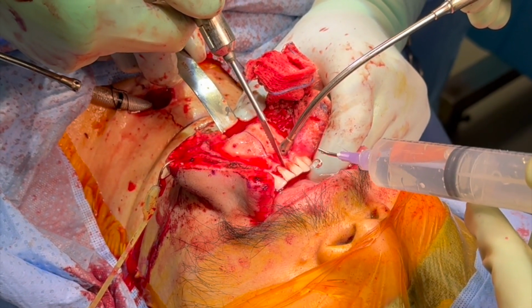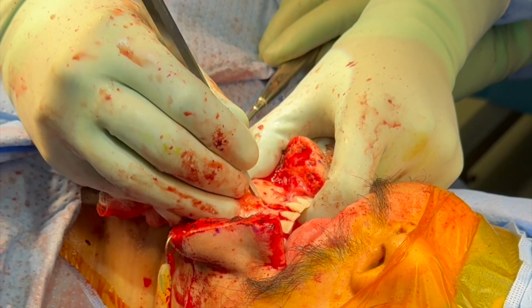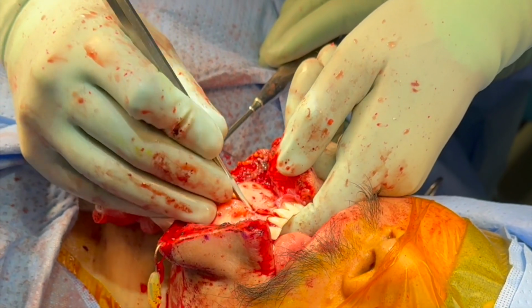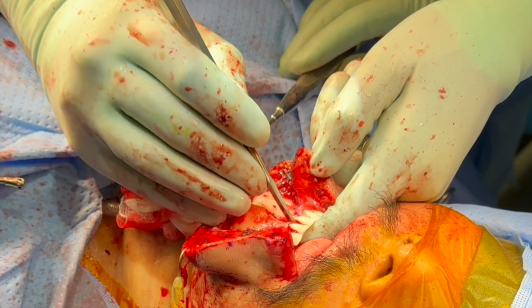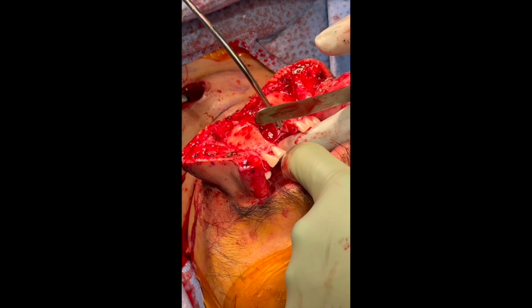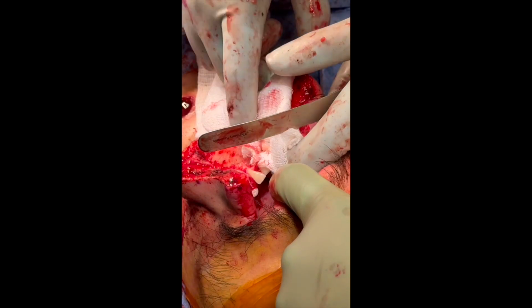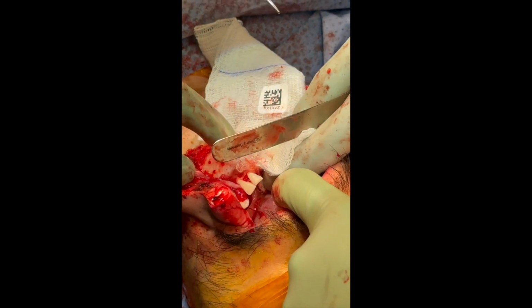along the midline. Here, the surgeons use a combination of osteotomes and a reciprocating saw to split the mandible. For this procedure, the patient should be counseled on the need for a tracheostomy and feeding tube due to expected postoperative swelling.